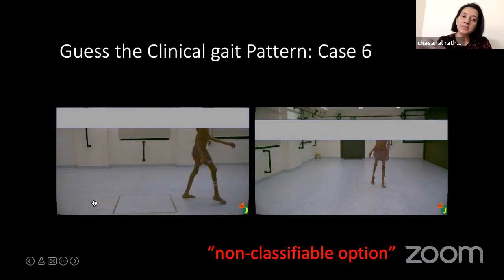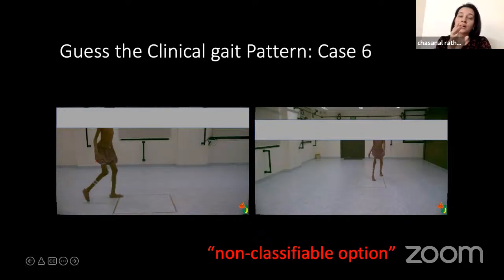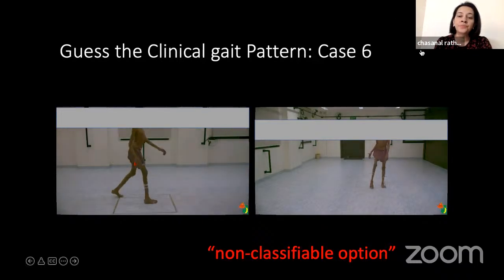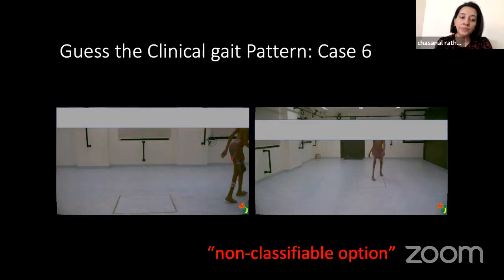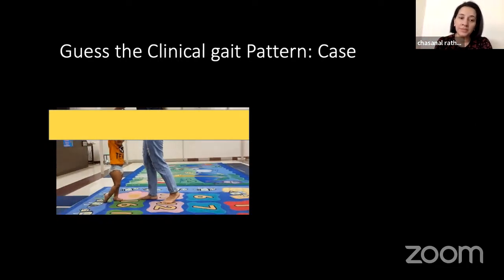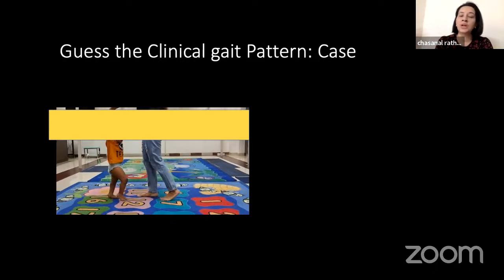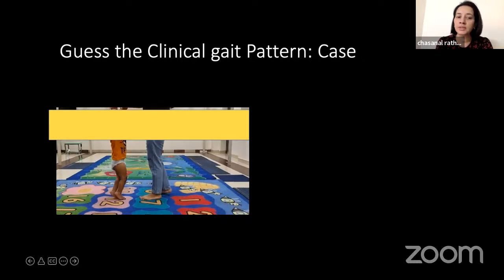And the cases we saw before were very classic cases, which can be grossly labeled as what type of gait. But most commonly, we'll always come across children who will not have a classifiable gait. And that's where the 3D gait analysis works. And that's how it helps. Because now we can explain what is happening at both the limbs. And no more would we call a child a jump gait or a crouch gait. Now, if you look at this child, he's almost 6 years old.